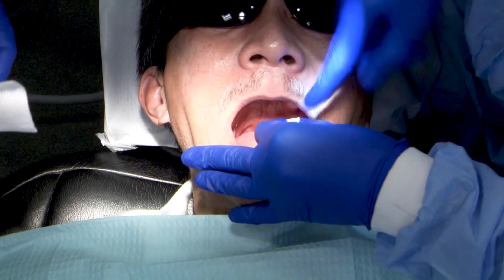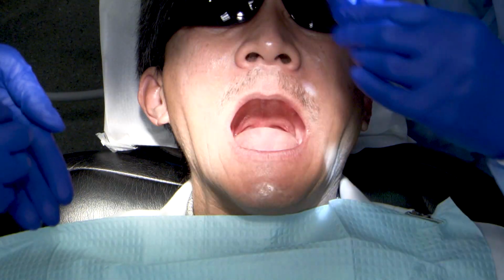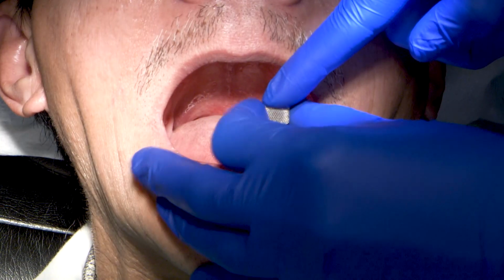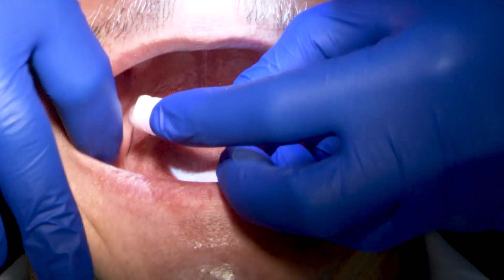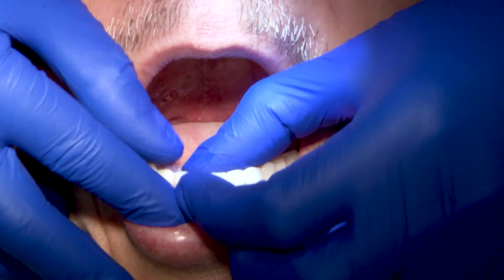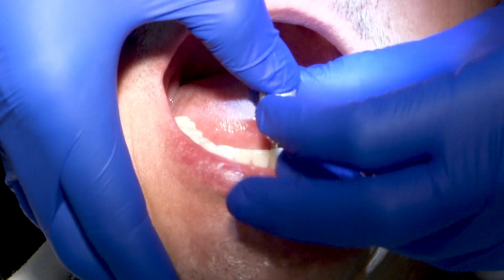The patient currently has a complete upper denture and a complete lower denture, which is sitting on top of healing abutments. We are in the middle of fabricating a BruxZir full arch prosthesis for the lower arch. The first thing I'm going to do at today's appointment is to remove the healing abutments so we can then try in our wax setup.